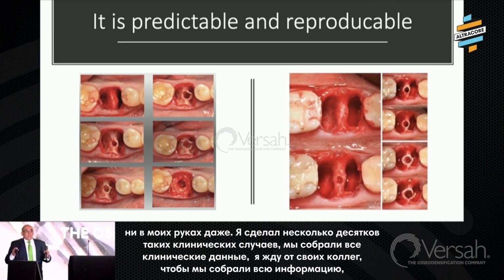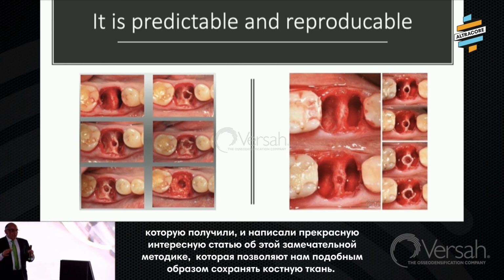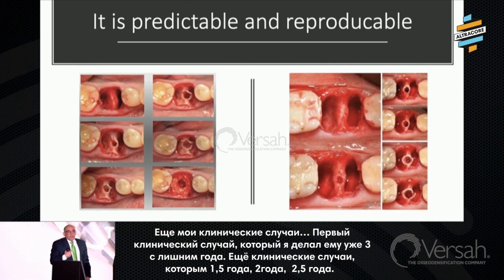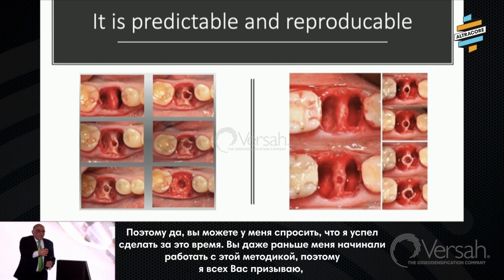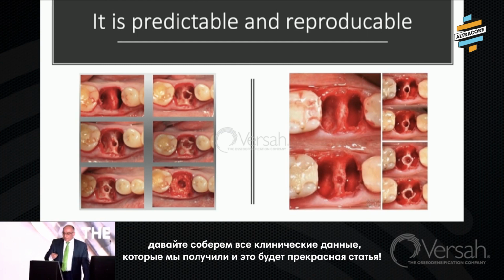We collect all the data, and I'm waiting for my colleagues to just not be lazy and put it together. We are ready to go with beautiful articles about this technique, which allows us to keep the bone there. With my cases, I have one case of about 3 years, the other cases 1.5, 2 years, 2.5 years. So just ask me. Yes, thank you, but you are a little bit earlier than me. Be acquainted with this beautiful person. So I ask you, really, let's put it together. It will be a very interesting article.